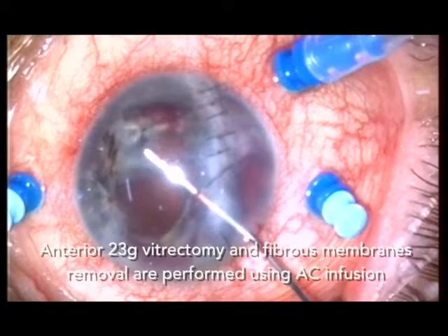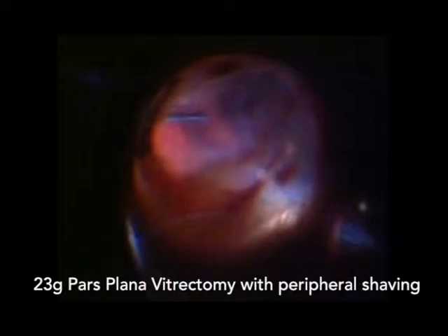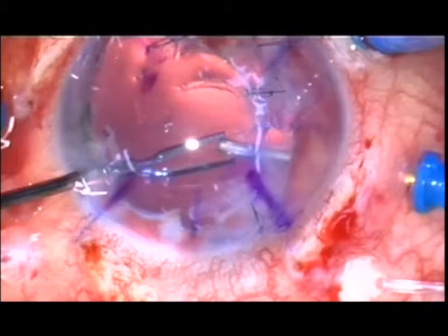Anterior 23 gauge vitrectomy and fibrous membranes removal are performed using anterior chamber infusion. 23 gauge pars plana vitrectomy with peripheral shaving. Fibrous membranes removal from the angle using 23 gauge scissors and forceps.